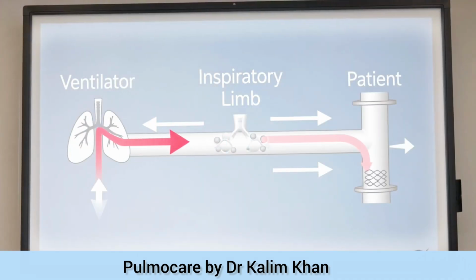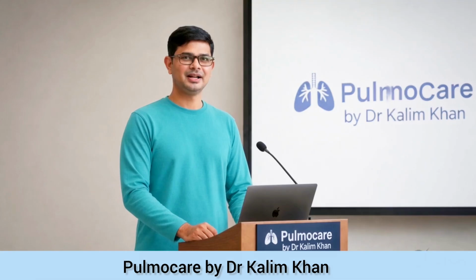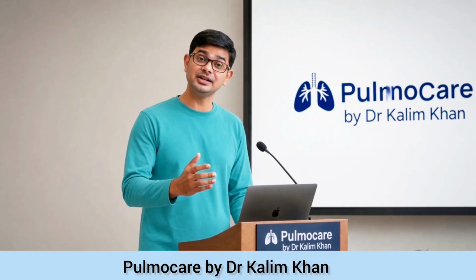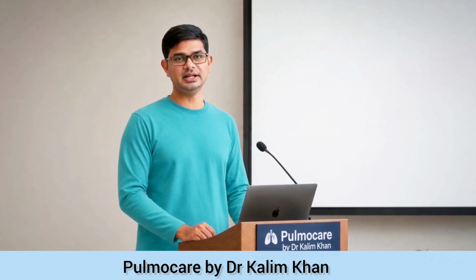The first part of the breathing circuit is the inspiratory limb. During inspiration, gas travels from the ventilator through the inspiratory limb toward the patient. Depending on the circuit configuration, components such as a humidifier and filter may be present along this pathway. The inspiratory limb should remain patent and free from kinks, obstruction, or accidental disconnection. Any significant obstruction can increase resistance and interfere with delivery of the intended breath.